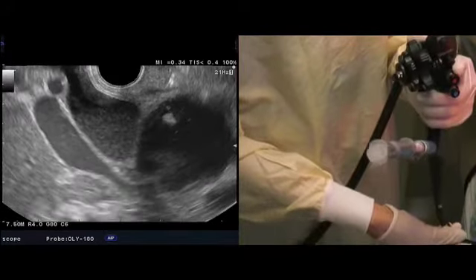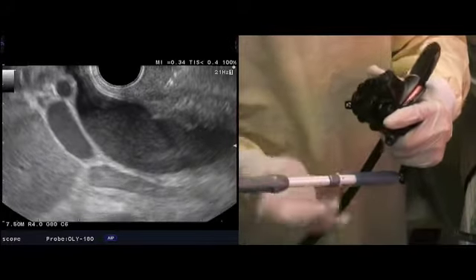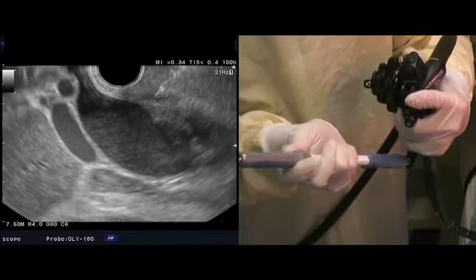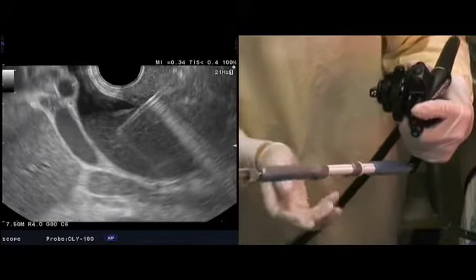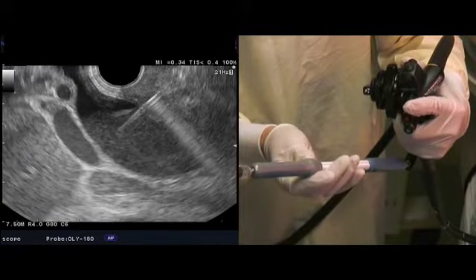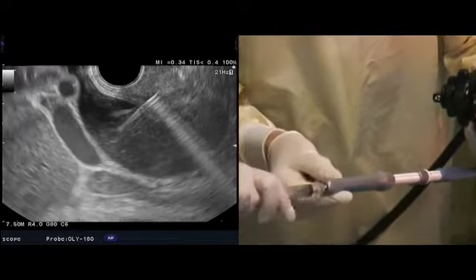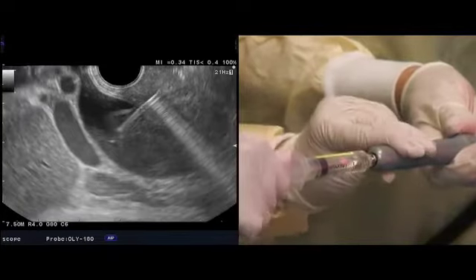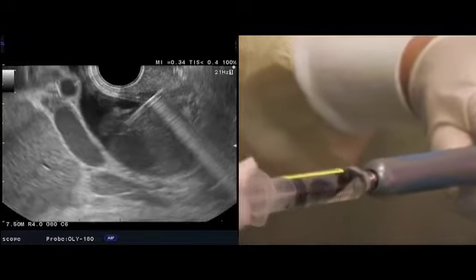We want to stay away from that cyst — so there's the cyst, we want to keep it sort of like this. Now I'm advancing the needle forward and I'm in. Jeannie is going to aspirate a little bit. You should see some bile come back — you should get some bile unless the bile is white. You can see that's dark bile.